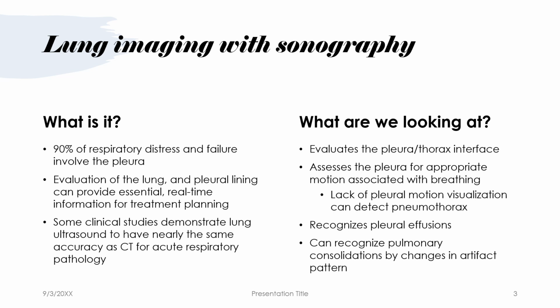So usually we use ultrasound to actually look at a particular organ and evaluate its echo texture and different things about the organ itself. Well, when it comes to lung, because it's filled with air, air just scatters our ultrasound beam. But how it's useful to us is that we can actually evaluate that scattering pattern or the artifacts it produces to determine if that lung is truly filled with air or not.